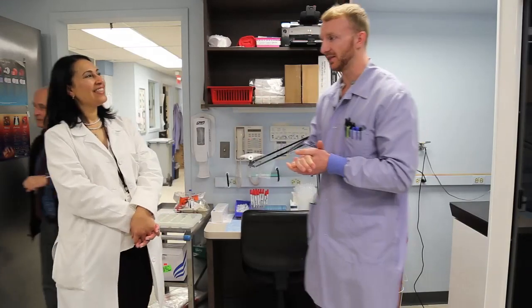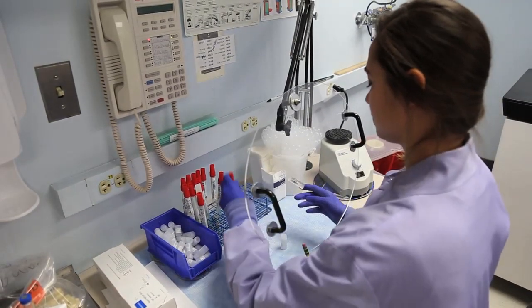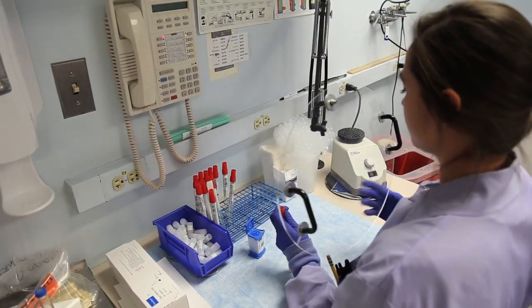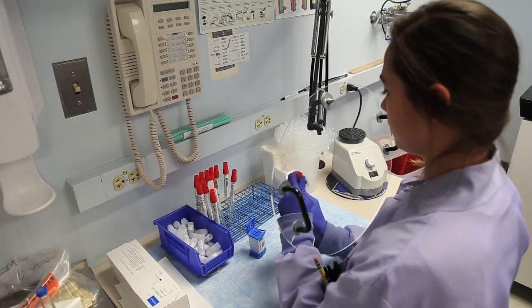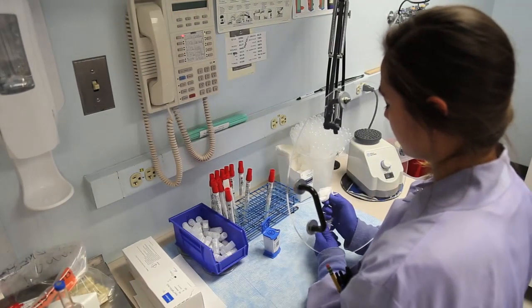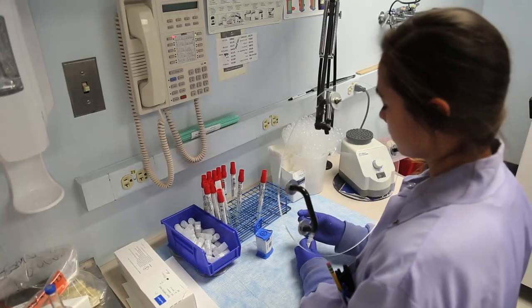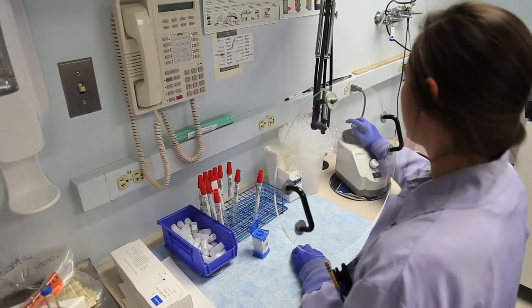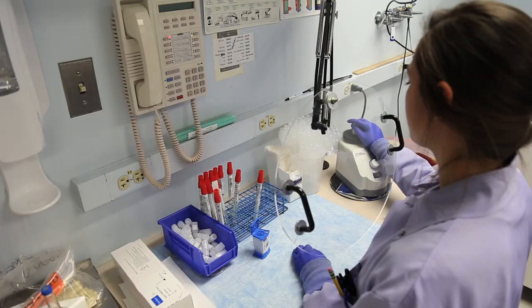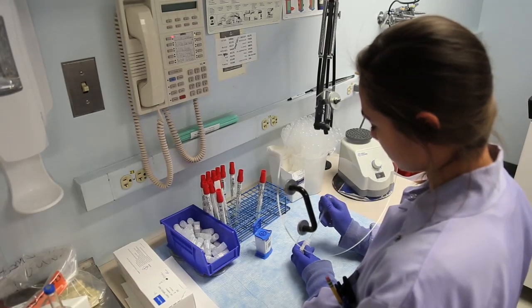Wow. And we actually have somebody who's going to set up a couple MRSA swabs here as a demo. Wonderful. So here we have Indigo, and she has a MRSA swab, which is just a swab of the nares. She's labeling the Cepheid cartridge, and then she's going to rub the swabs together just to get any organism that may be on one swab but not the other. Then she'll break that swab off into a buffer that's needed for almost all PCR reactions, and vortex that for 10 seconds just to really get any of that DNA, any of that cellular material off. Then she's going to pipette that buffer combined with the DNA material into the cartridge.